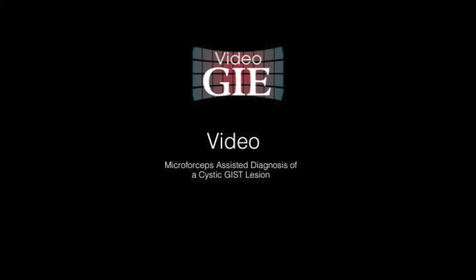This video is titled Microforceps-assisted diagnosis of a cystic lesion.